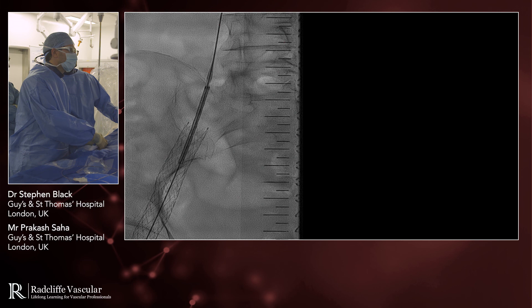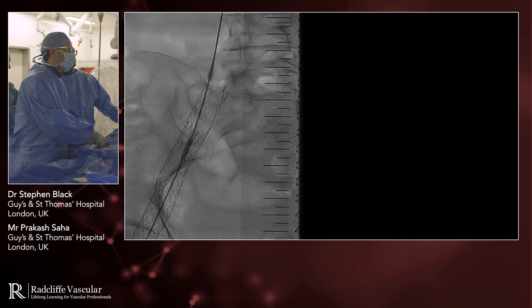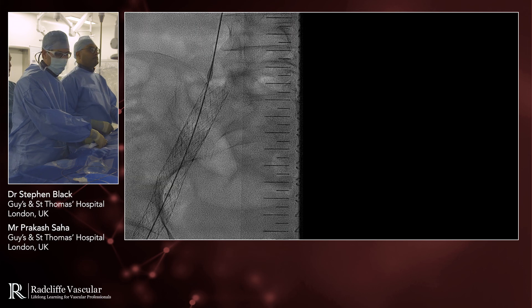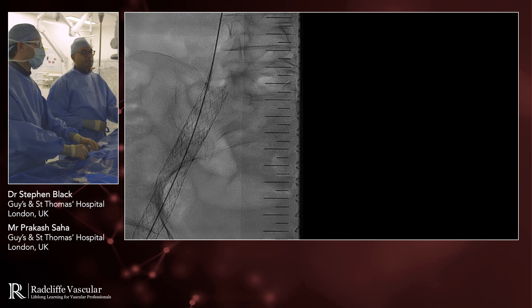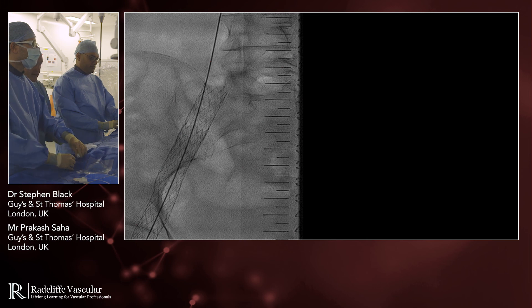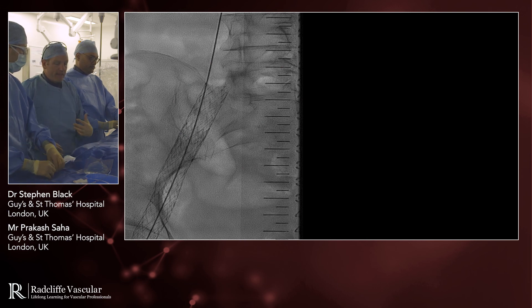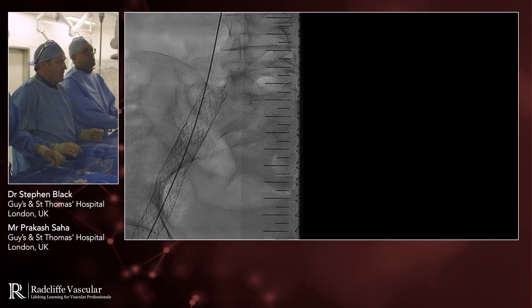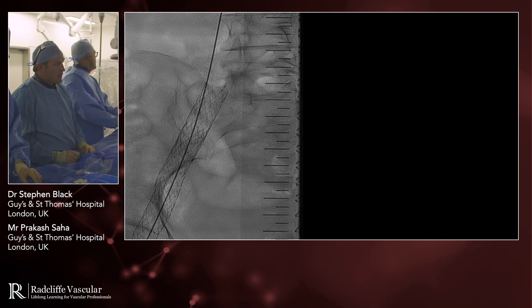So the same thing as the last stent. The main principles here are good to good, but also paying attention to points where you're going to get flexion in hip movement in the vein, where you can start to get problems at the inflow or outflow by creating a transition point in an unstable region — that can also cause problems with the stents in the long run.